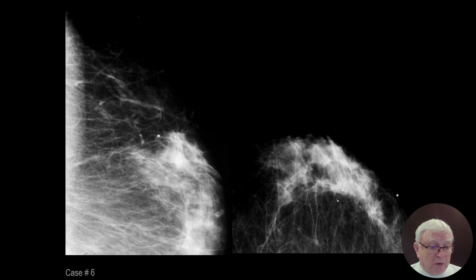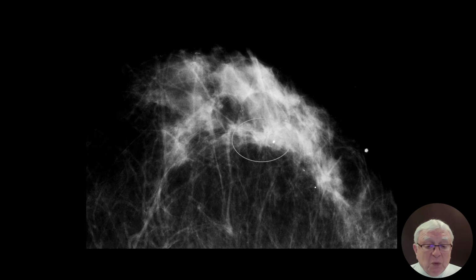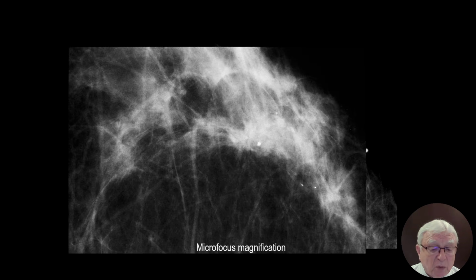Now I'm just wondering whether you see something she felt. Very difficult. And you know, it's not there where the BB points out. It's actually here. What? You want to show me a palpable radial scar? Yes, I'm going to do that.